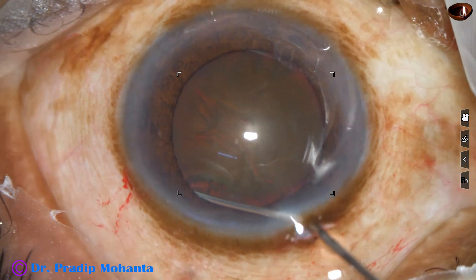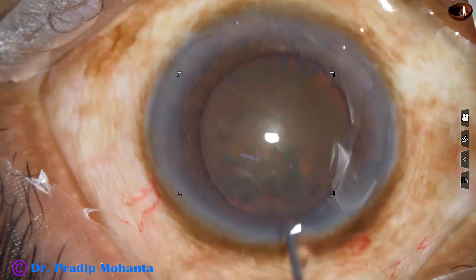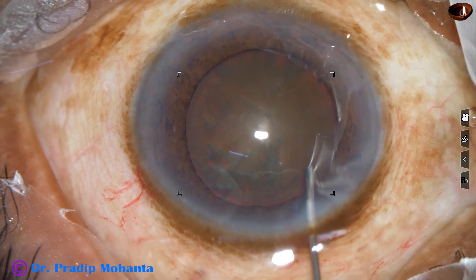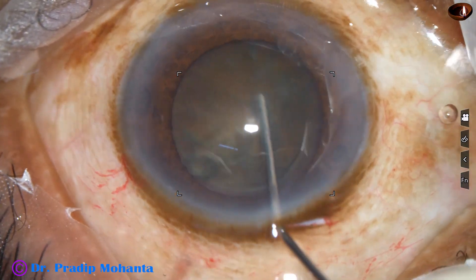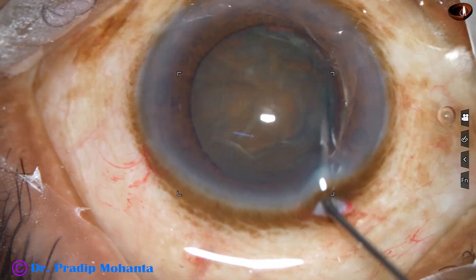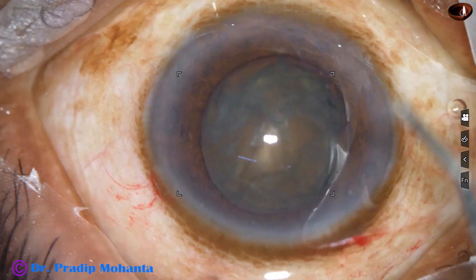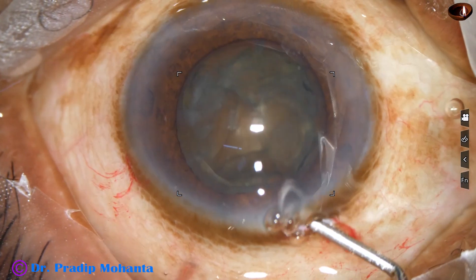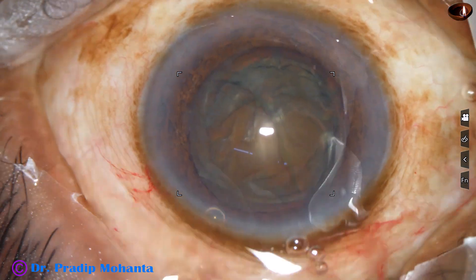Hydrodissection is done very gently. We could see the fluid wave in this case. The nucleus comes forward, is tapped gently, and then mobilized. The nucleus rotated freely. Some more viscoelastic is added and the anterior chamber is filled up.